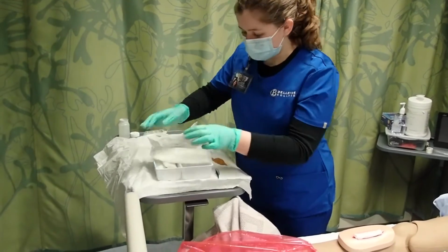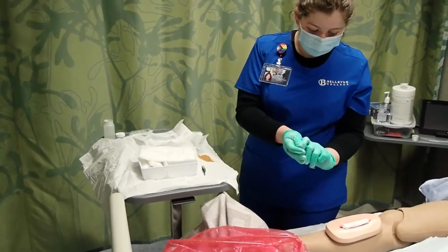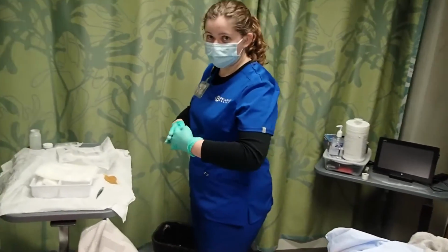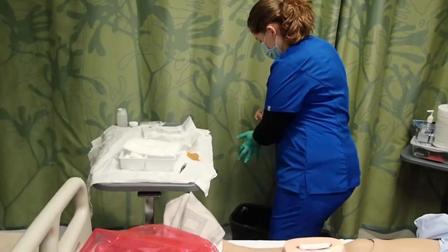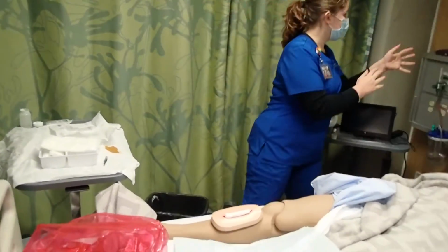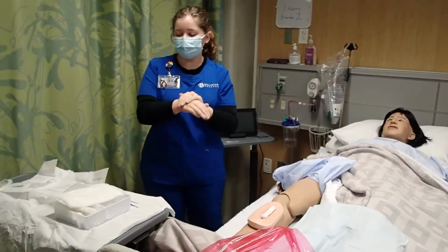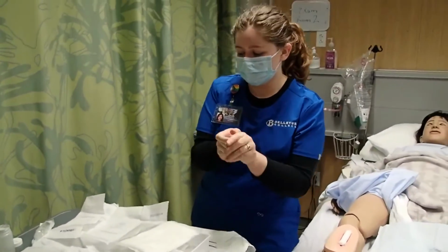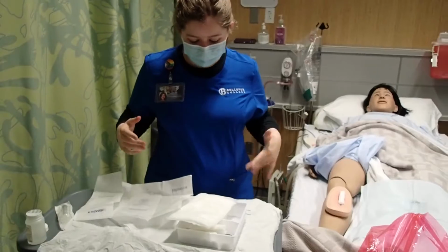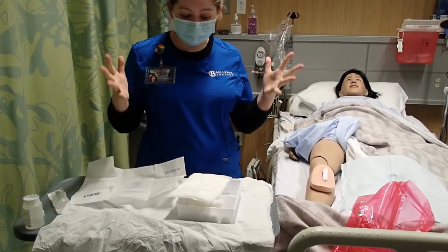I'm going to dispose of my sterile gloves. We have to make sure I have my gloves back there. Perform hand hygiene. Okay. And then where do you want these? Move them out of your way. Now we'll put on a pair of clean gloves.